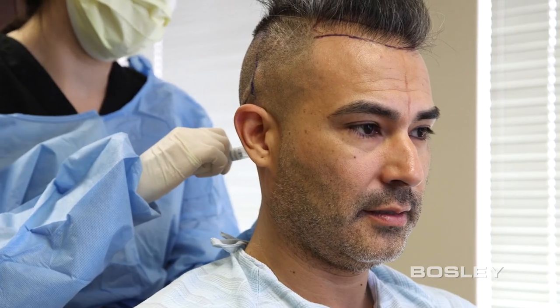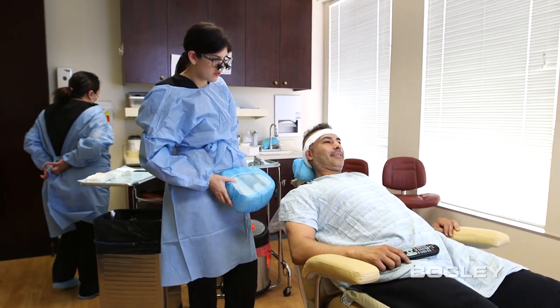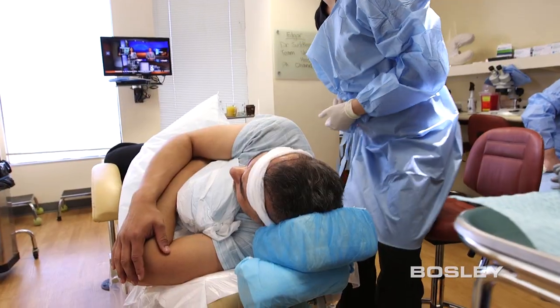Before the procedure begins, we administer local anesthesia just under the skin in this area. Once the donor area is prepped, we'll recline you comfortably in position and begin the process.